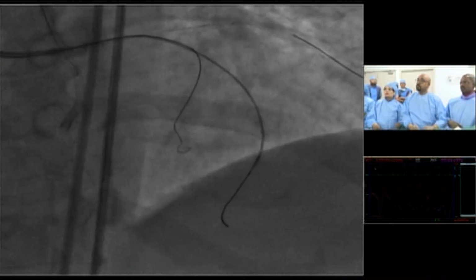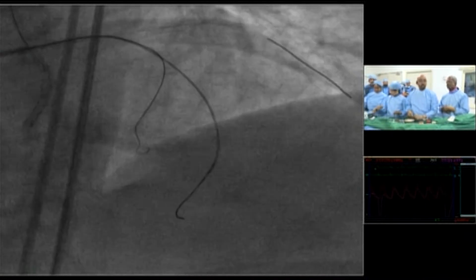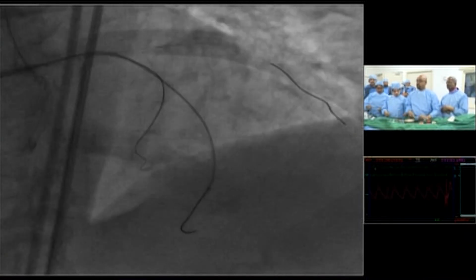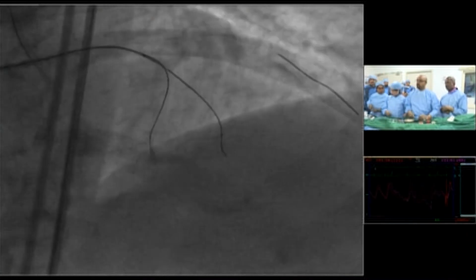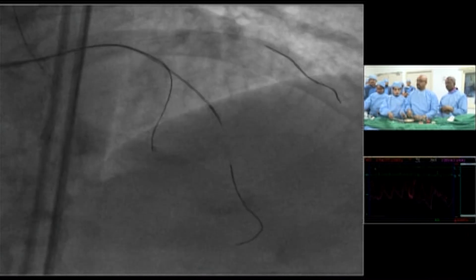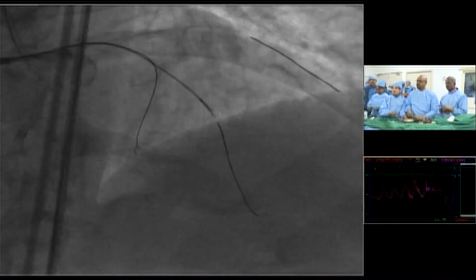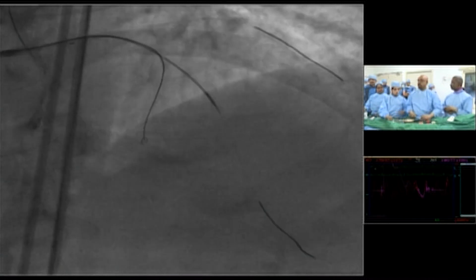It's in the septal. I think there was microcatheters. If there was a problem with crossing distally, just leave a wire and take a 1.5 balloon and then make some. Yeah, I didn't hear that. What was that? No, I think now you're out of the septal. Go down, that's better. That's better. Give the trap.